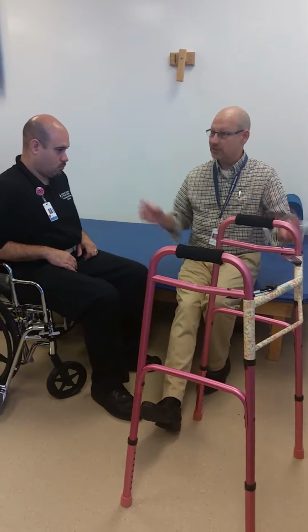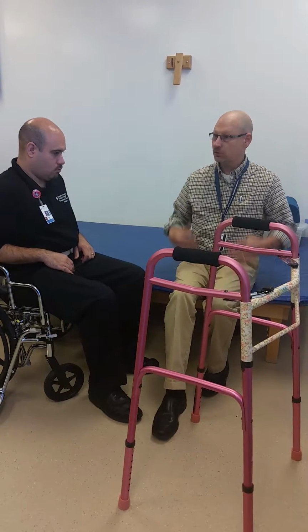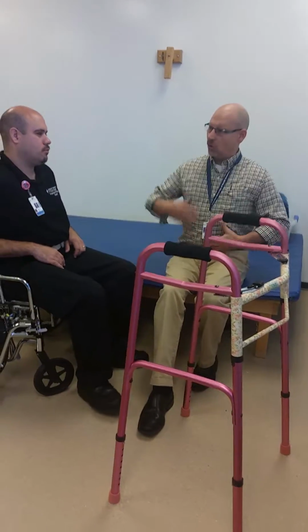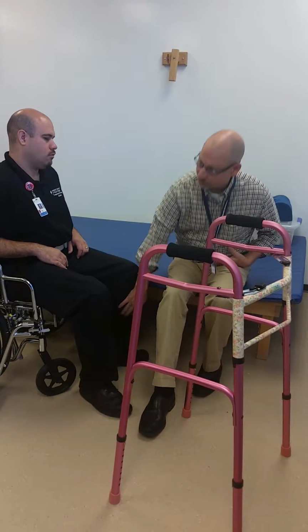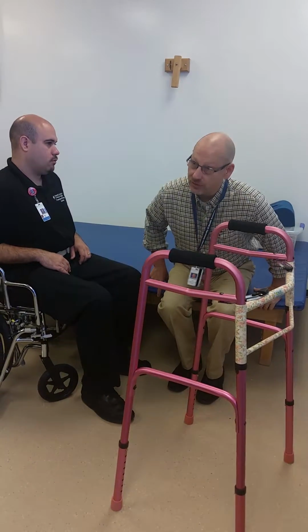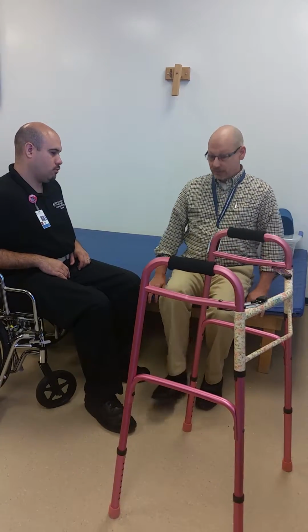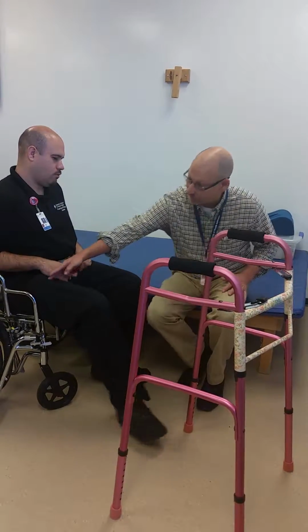In order for all of us to stand up, what do we normally do with our upper body? We lean forward, right? We put our center of gravity over our base of support. Here's his base of support. Now, Randy can't do this, right? Because he's got hip precautions. So what do we need to do? We need to have him extend his femur.